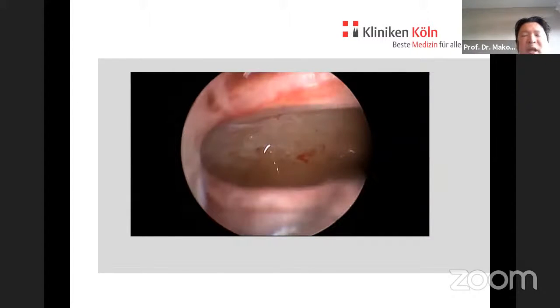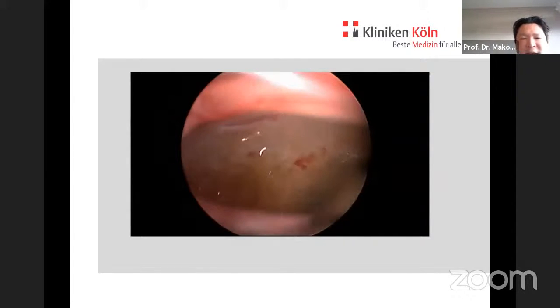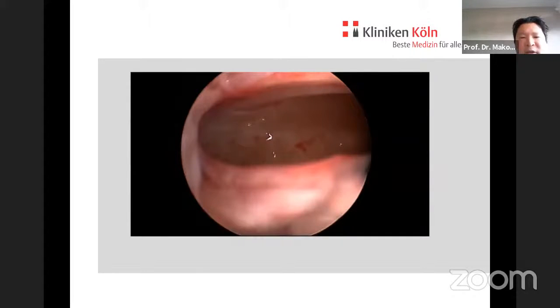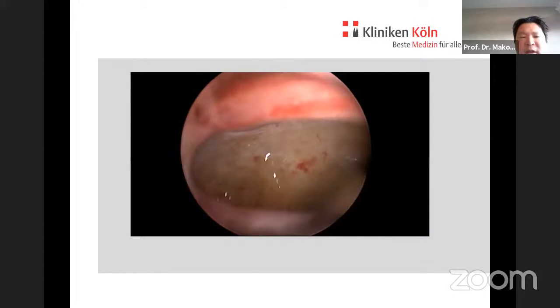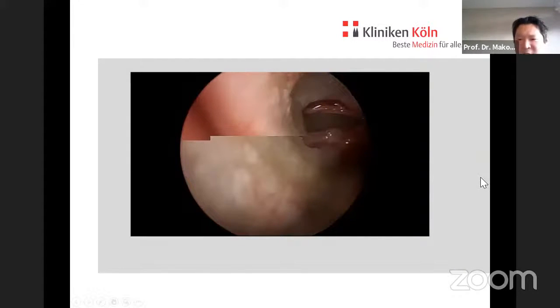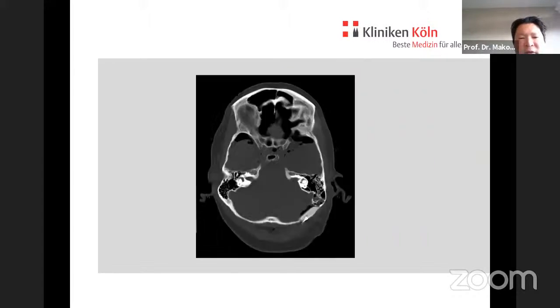And so this can be really nicely done with a retrosigmoid approach, even in small tumors which are in the inner auditory canal. So in my opinion, you don't need to do a middle fossa approach or any alternative to remove this tumor. And with the addition of the endoscope, you've got a very nice view there.